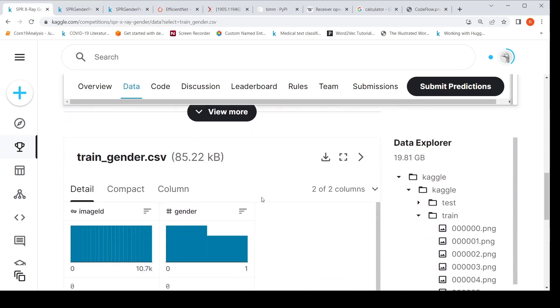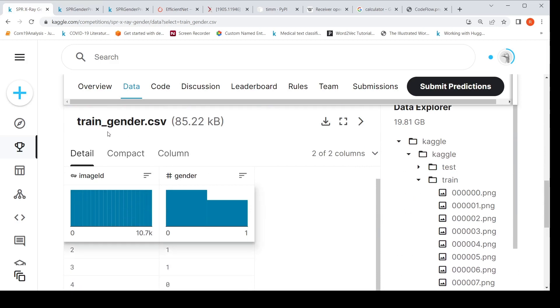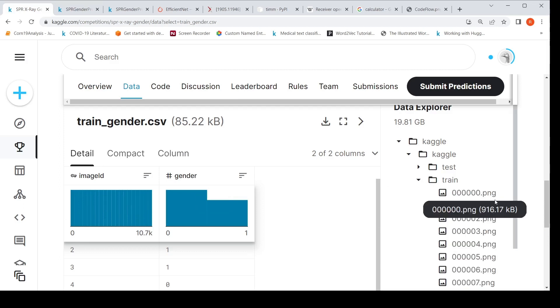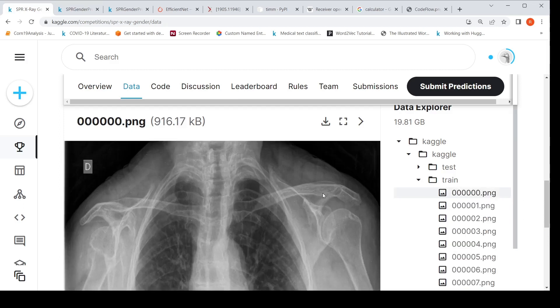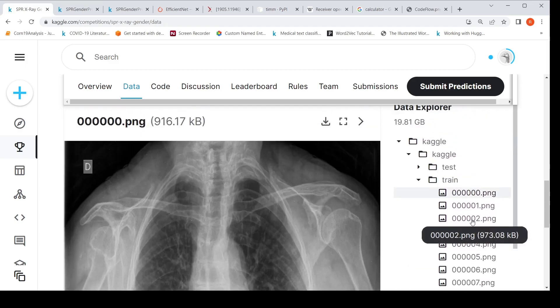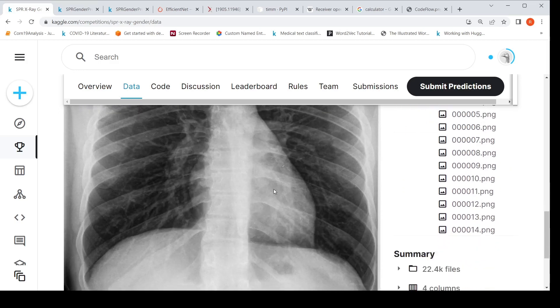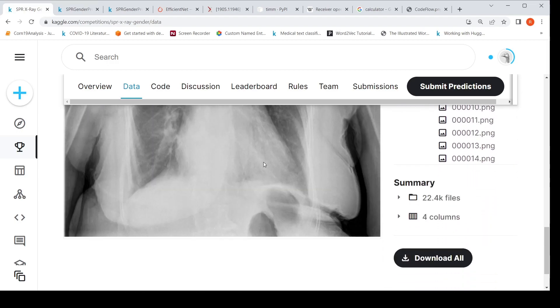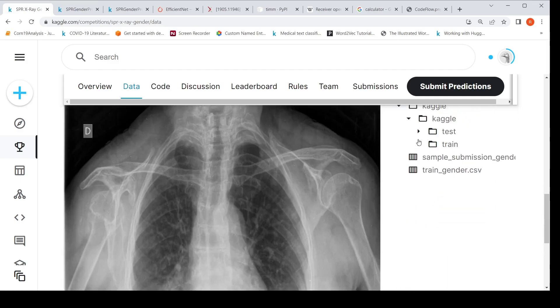In the dataset we have a train_gender.csv file which has an image ID and a gender column. Then we have corresponding test and train folders. Corresponding to each image ID, there is an x-ray image in that folder. Zero stands for female and one stands for male — so this is an x-ray image of a male patient, and this is an x-ray image of a female patient.